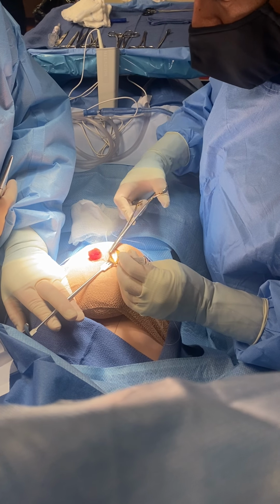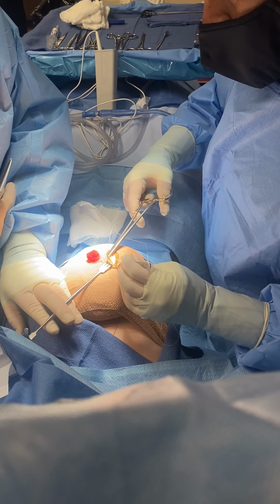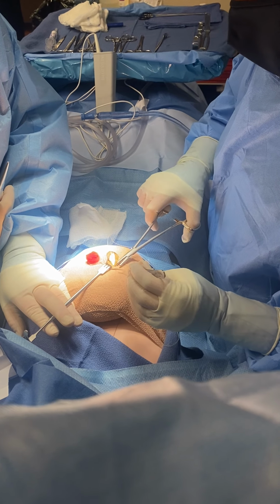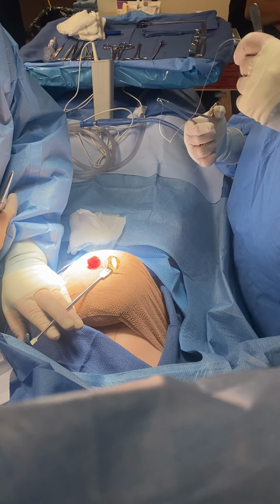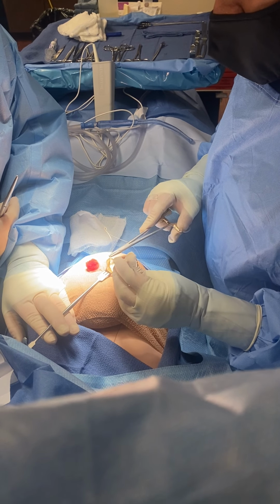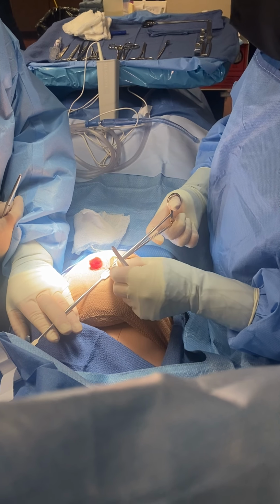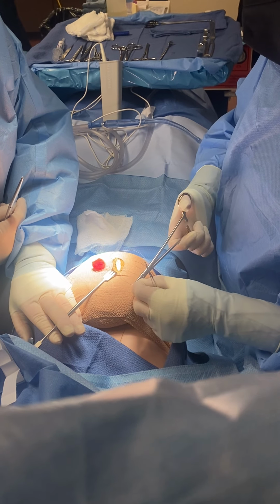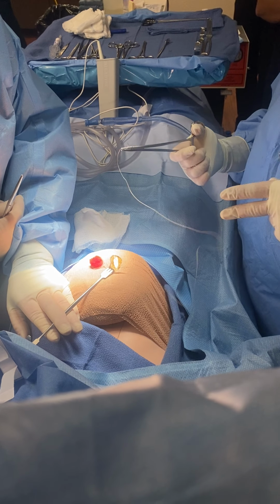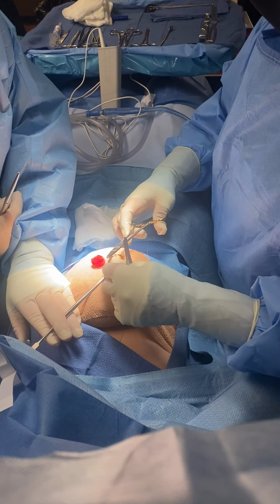Oh. It's like, you know. This needle. It's all the time. We need a heavier needle for this, maybe. A CT or something. A CT too would be good. She's just got some really tough tissue. Fibrotic tissue. Yes, fibrotic. Fibrotic breast. Well, don't poke yourself. Oh no, that was really bad. First rule. Don't hurt yourself.